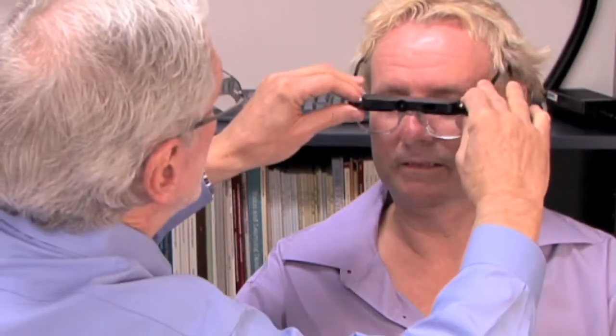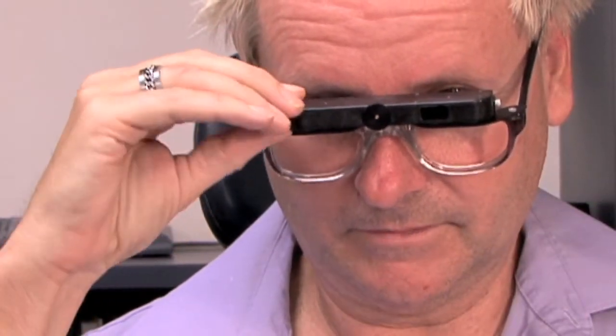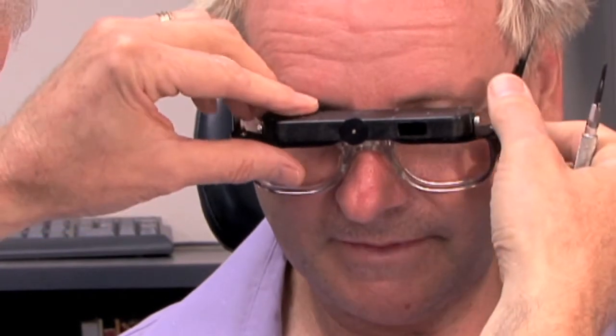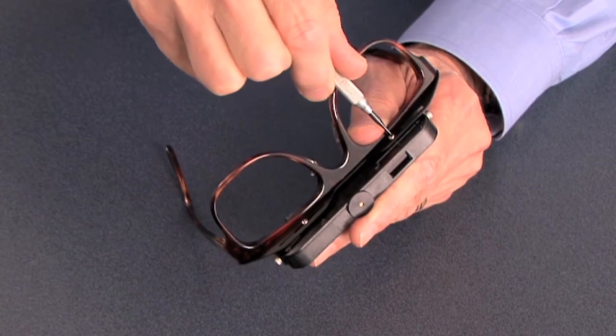We'll place it on the patient, drop the head down to look into the eyepiece, and slide the telescope right to left until the patient can see a full view coming in through the eyepiece. Then I'm holding it so that it won't move and I'll tighten that screw so it stays in place.